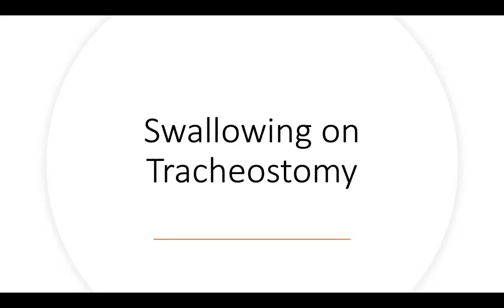But when you put the speaking valve on, you restore air to the upper airway. Basically, you have more air restoration to the upper airway. Does that make sense? During exhalation, all the air will escape to the upper airway, unlike if you don't have the speaking valve on, where some of it will go to the upper airway and some of it won't.